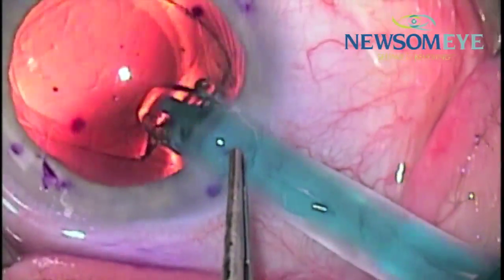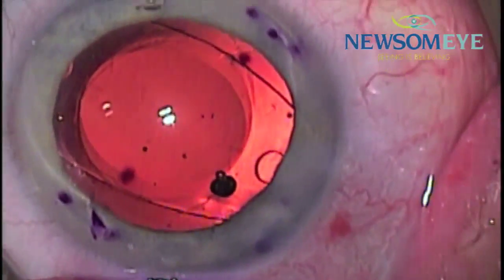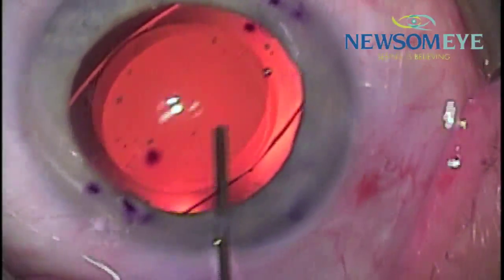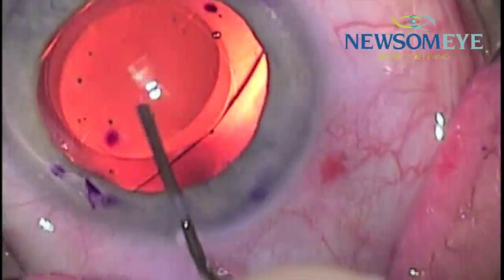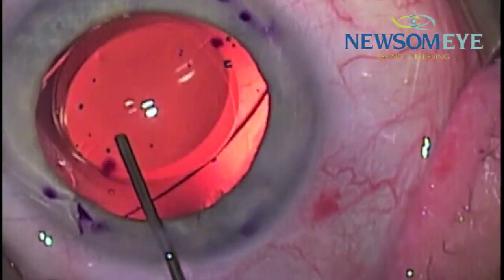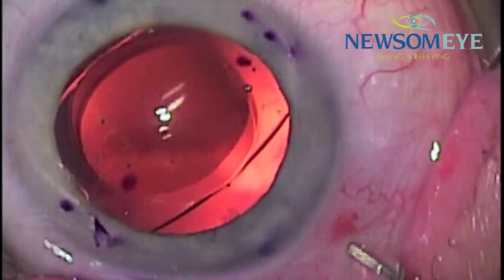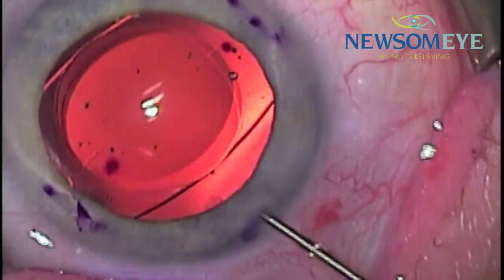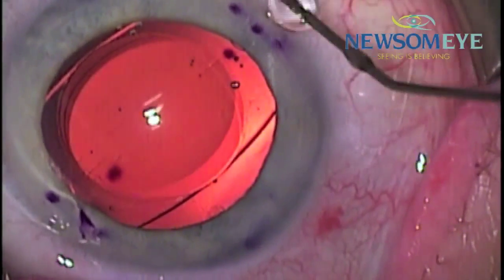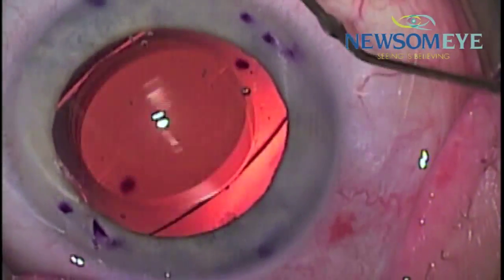You then see the lens being inserted. You will see two lines along the axis of the lens, which will be lined up here at the two o'clock and eight o'clock position. You'll see the purple marks along that axis which represents the astigmatism.